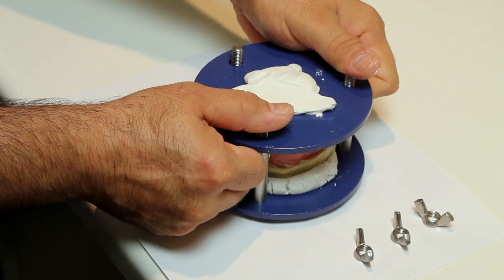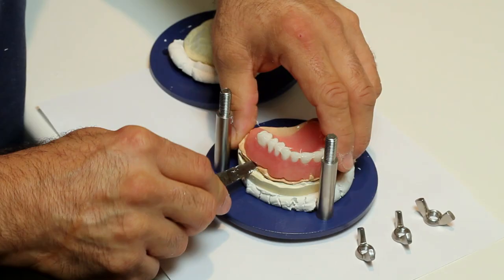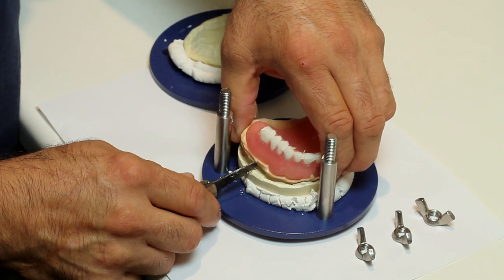Open the jig by unfastening the wing nuts. Carefully remove the denture from the model and index.